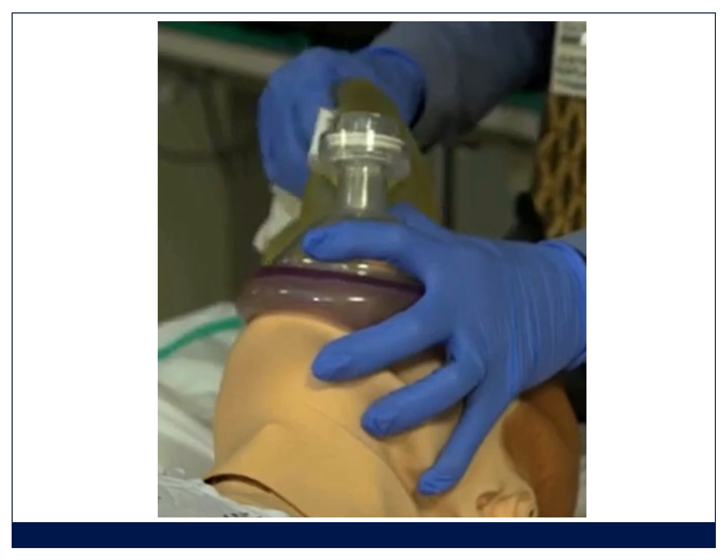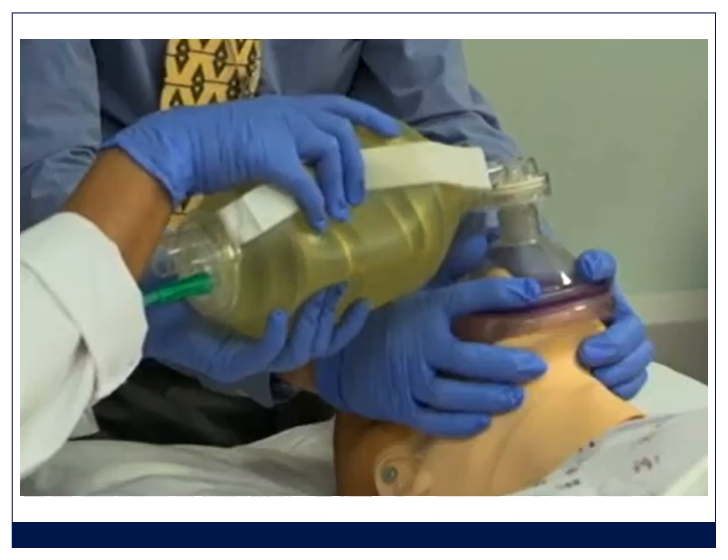Now, I find that quite difficult, either if it's a difficult jaw to lift, or in people that I'm teaching that have small hands or aren't used to doing this or not strong enough. This technique is actually very difficult to get the jaw up. So it's useful when it's an easy bag mask ventilation because it frees up a hand, but it doesn't work very well when you've got a difficult mask ventilation. So then you can consider using 2 hands when you're struggling.